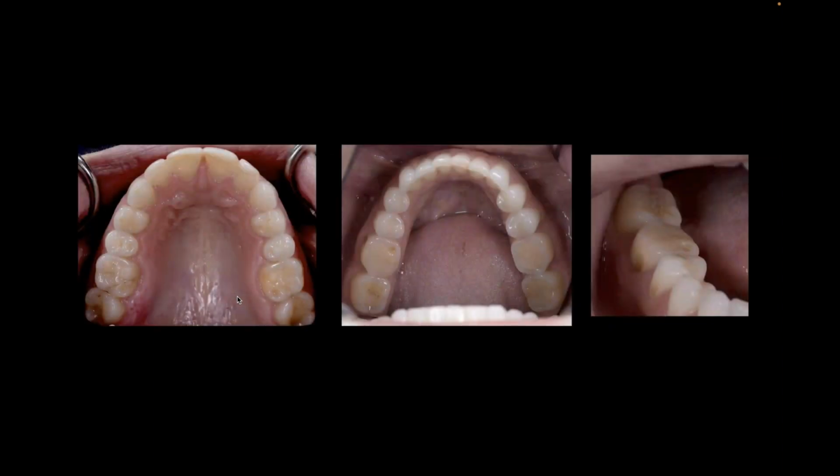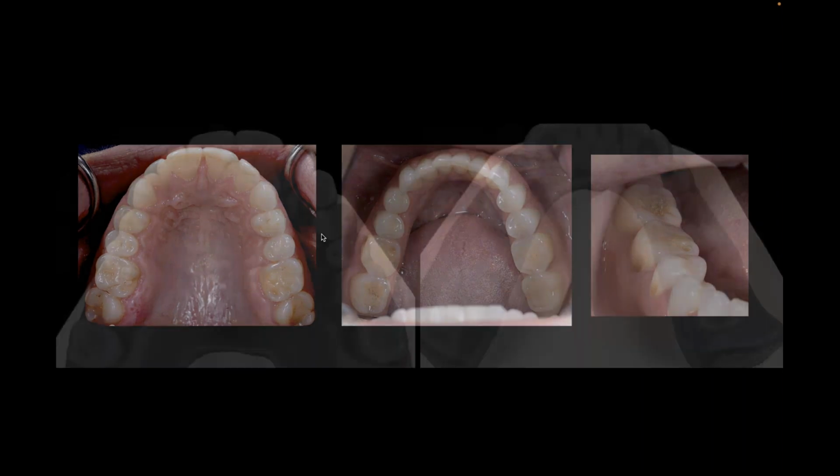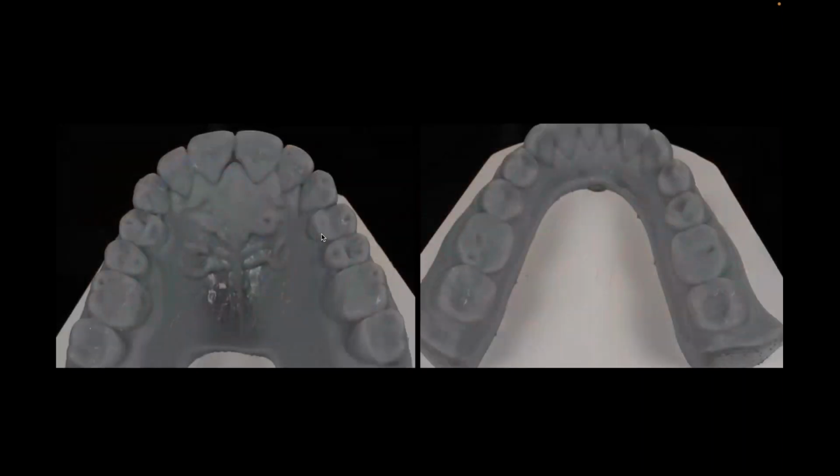And the other etiology in her case is there was some chemical wear, meaning that it's not just about the aesthetic process, that we're going to have to manage these teeth that she has and manage through the chemical wear. So they're going to have to be covered. But at the same time, she's young. I don't want this to be full coverage if they don't have to be. So this is why the combination materials is starting to become more challenging for us, because I'm already knowing that I want to stay something very monolithic and very thin here in the posterior, but she's very demanding on what she wants in the aesthetic zone. I shouldn't say she was very demanding.